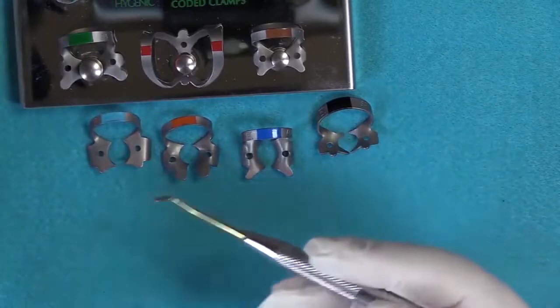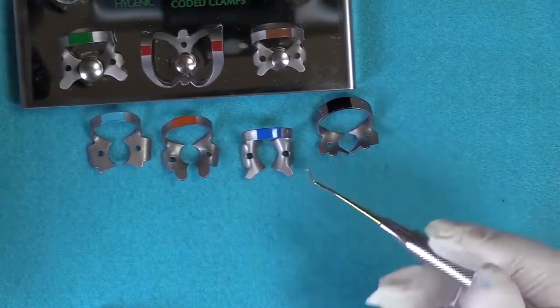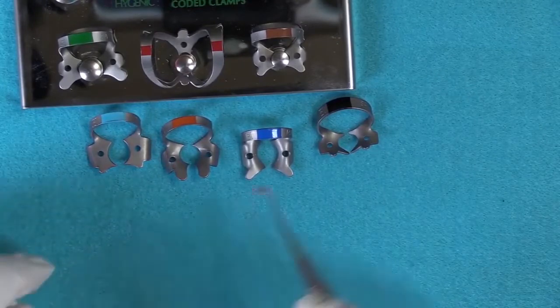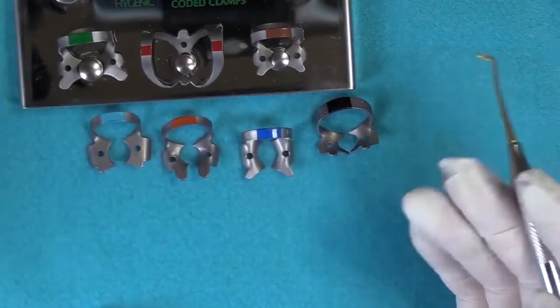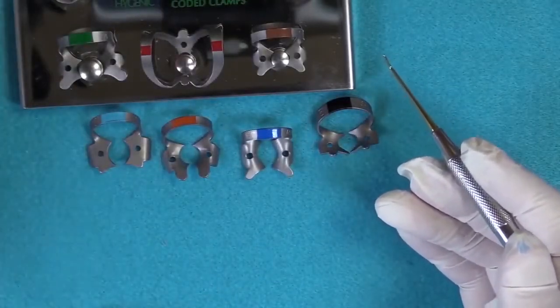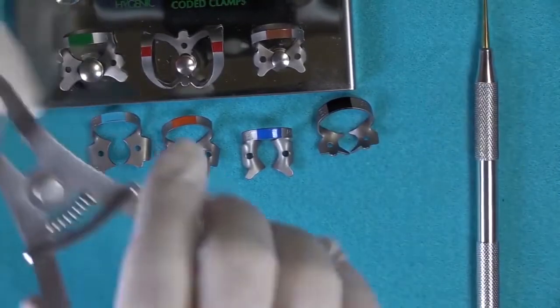Usually I like a number 3 if it's a medium to small molar. So it just depends, and that's really just a judgment call that you're making when you're looking at the patient, going, okay, I think it's going to be this or it's going to be that. And I really don't remember all the numbers. There are so many clamps. And that's another thing, too: the clamps in this series, you would use 80% of the time. The 80-20 rule. Absolutely. And then here are your serrated clamps.